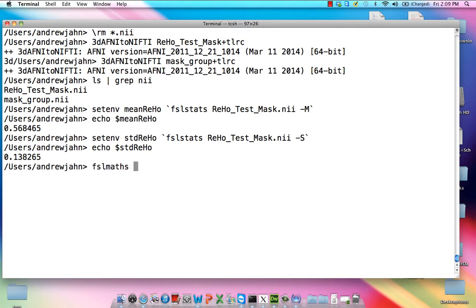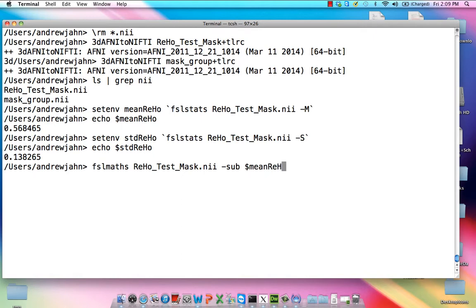Okay, we're going to input this RehoTestMask.NIFTI file. We're going to subtract the mean Reho variable and divide by sdReho. Oops, sdReho. Yes.